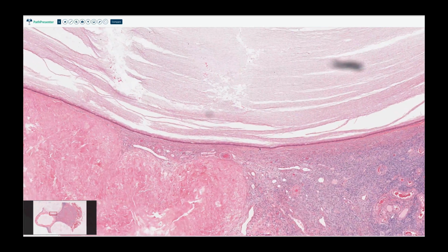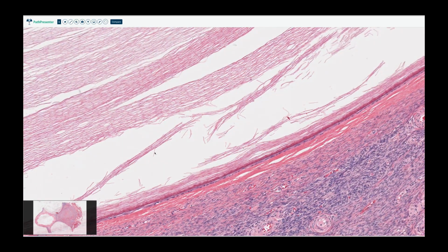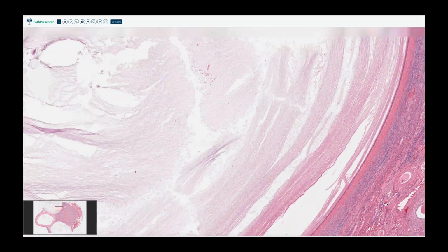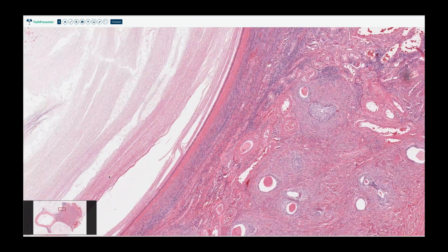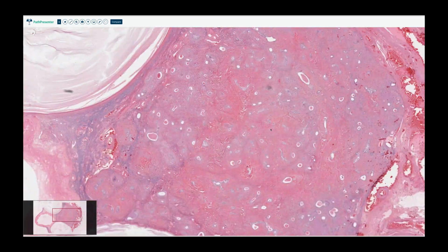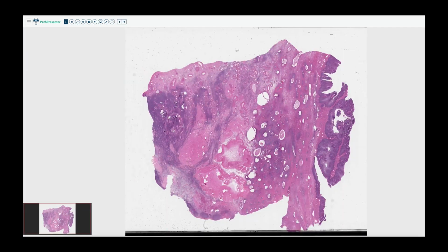So this one actually has some cysts associated with it, which when I looked through here very quickly earlier, I thought, actually, I think that's keratin, so that's a keratinized cyst, never mind. But sometimes you'll see mucinous metaplasia along with a Brenner tumor. Those things like to travel together. This is interesting that it has a keratinized cyst with it. Maybe this was part of a teratoma or something. Two lesions that ran into one another, but either way, lovely, nice, good prognosis for that patient.